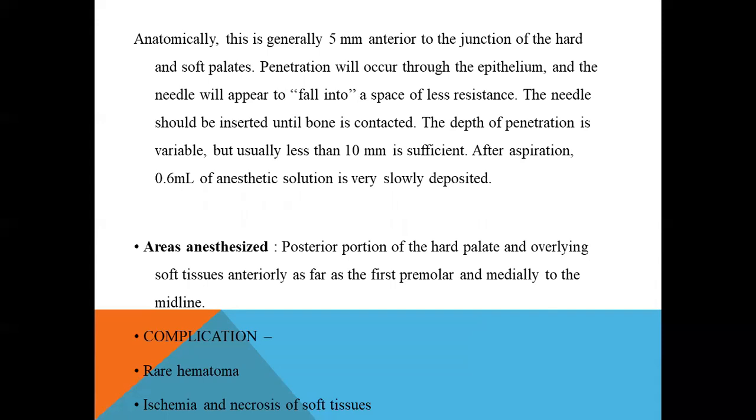The area that will get anesthetized will be the posterior portion of the hard palate and the overlying soft tissue, anteriorly as far as the first premolar and medially up to the midline.